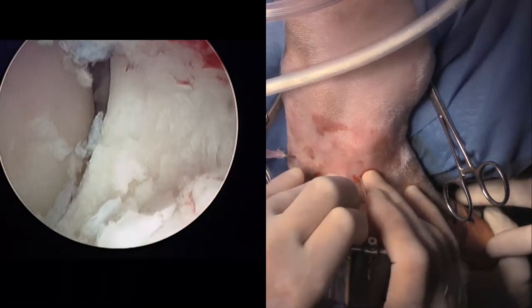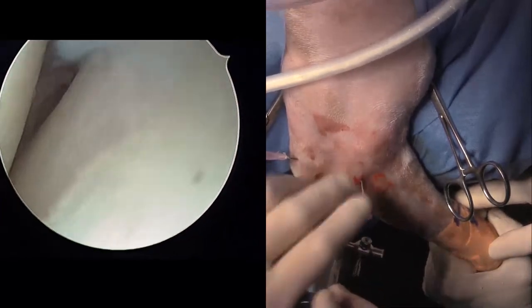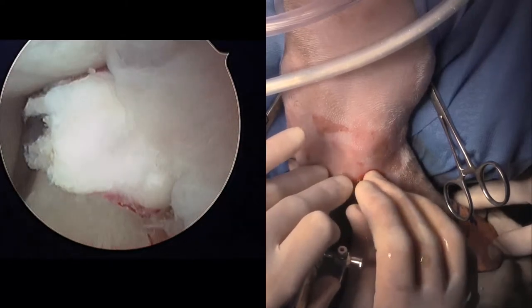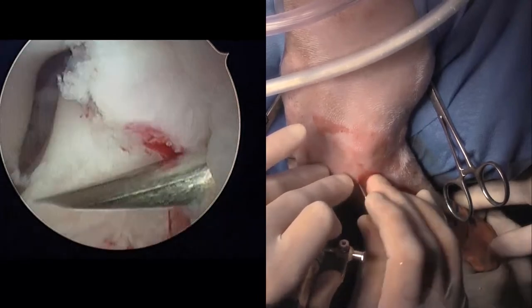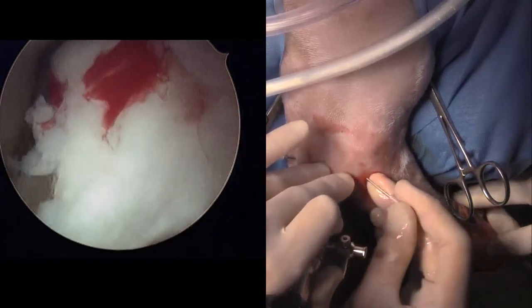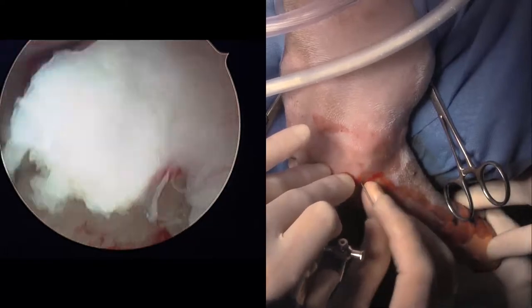Where are you? And I'm looking in the direction of the needle there. It should just be right in front of us. So that's all fragment right there. I feel like there it is right there. So there's my needle. So now I'm just going to try to elevate the fragment and just try to release it from the surrounding soft tissue.